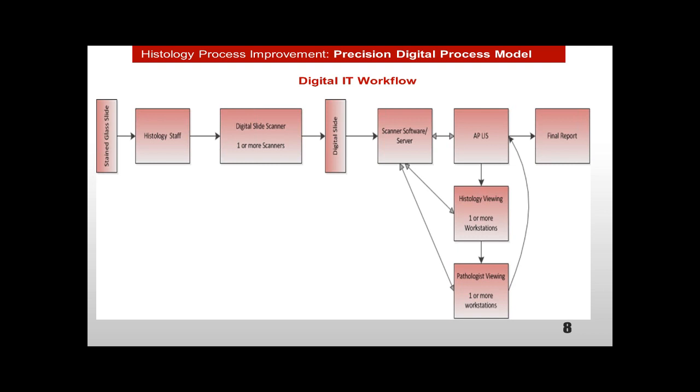Once we've created the digital slide, there has to be all this communication on the IT side with your slide scanner software and server. You've got an AP LIS. You've got possibly another hospital LIS. All of these have to be interfaced, integrated, and working seamlessly, so it comes in and out.